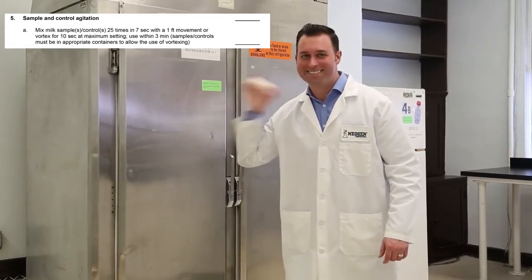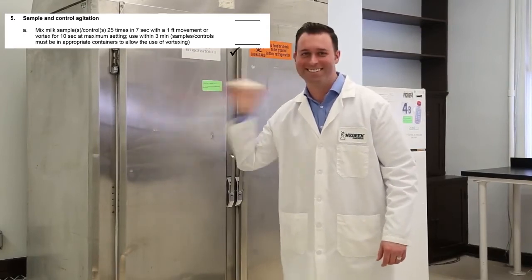If you don't look as ridiculous as our host right now, you aren't mixing your milk sample properly.